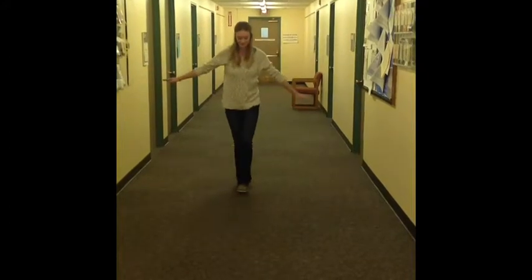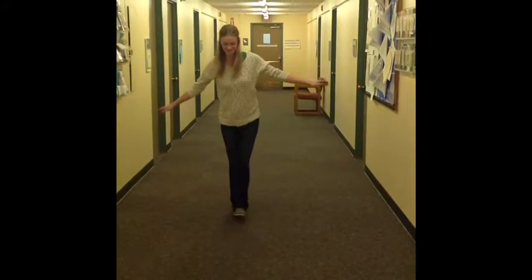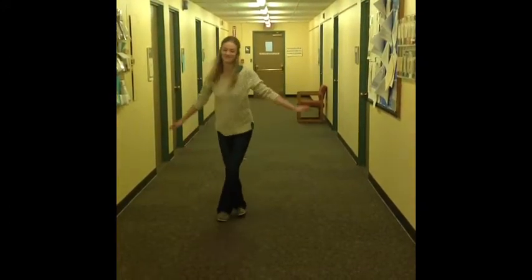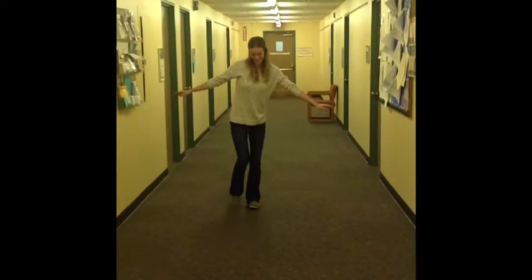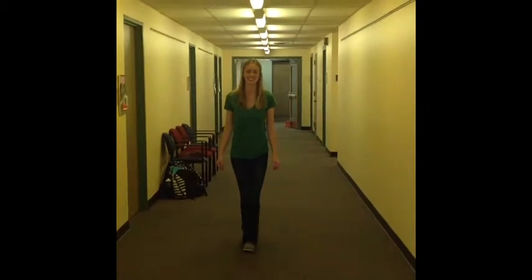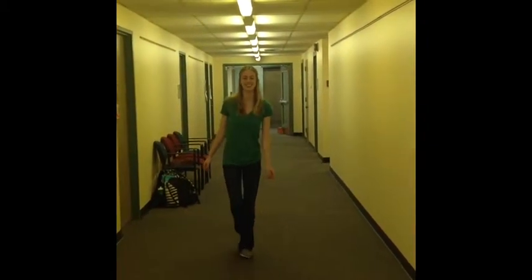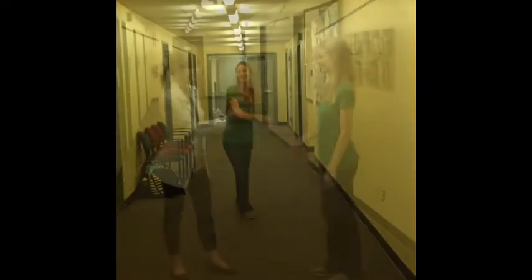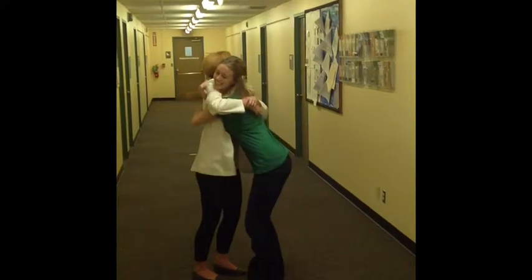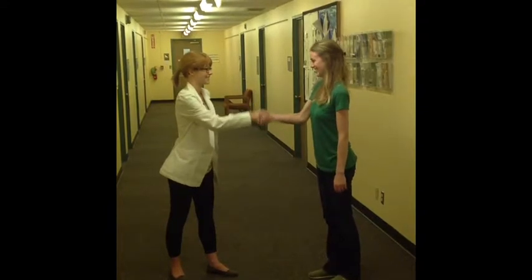Here's our patient before her therapy. She's trying to walk in a straight line forwards and then backwards. Here's our patient after the therapy. As you can see, her balance has improved greatly. One of the great rewards of vision therapy is the satisfaction you get when you make patients happy.